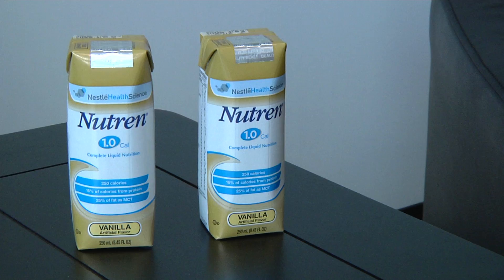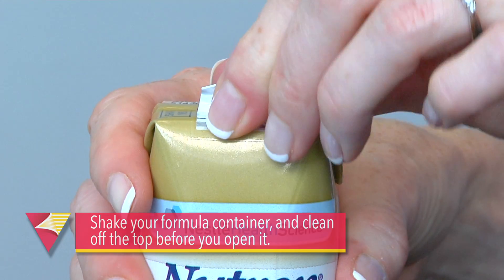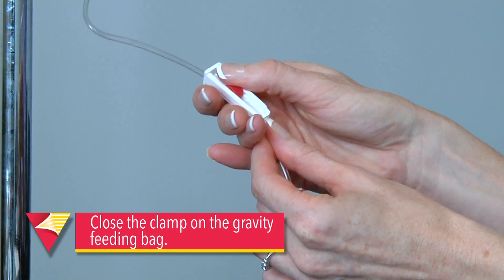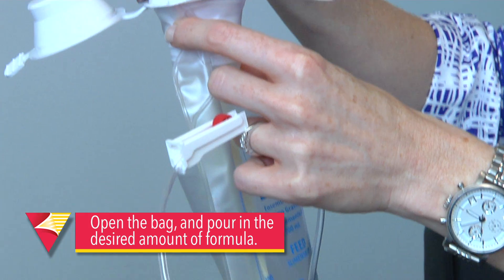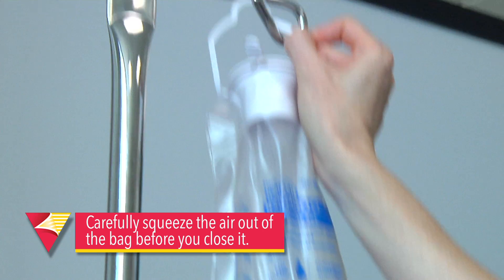Now go ahead and grab your formula container. You'll want to shake it and clean off the top before you open it. First, close the clamp on the gravity feeding bag. Open the bag and pour in the desired amount of formula. You'll want to carefully squeeze the air out of the bag before you close it. Go ahead and hang the bag on the IV pole.